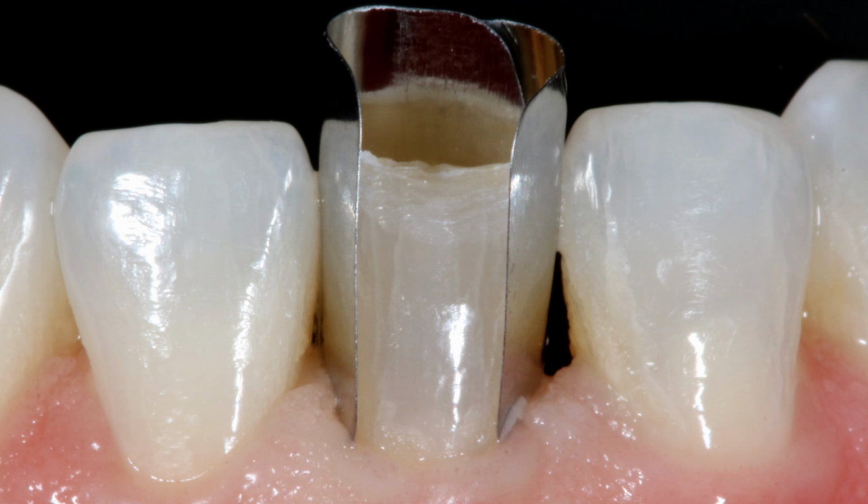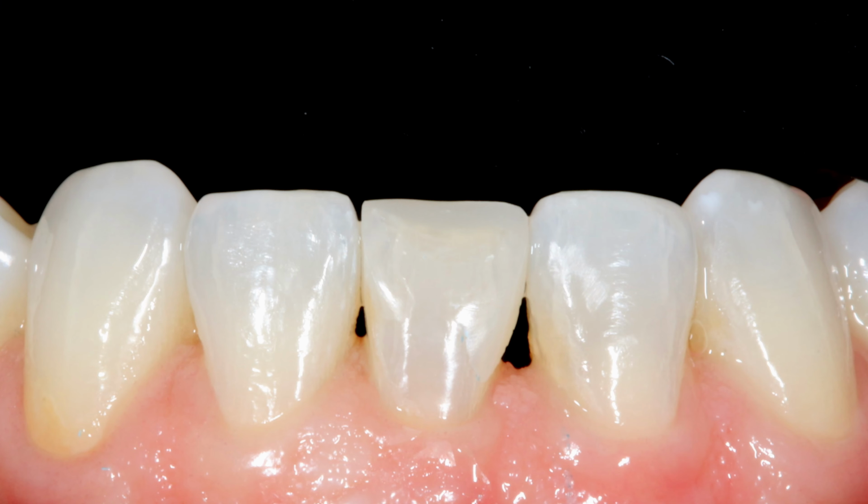What I would do for this situation is take my thumb and put a lot of pressure on the lingual of this tooth, really pushing these bands up against the lingual surface. Then I would inject the composite, and all I have to worry about is really the incisal edge and the facial, because my mesial surface and my distal surface are going to be taken care of, and my incisal I can get to and shape with my instrument. The lingual is taken care of with the matrix bands. There may be just a little lip here that I have to smooth out, but it's minor. This is with minimal shaping with a burr after adding that composite.